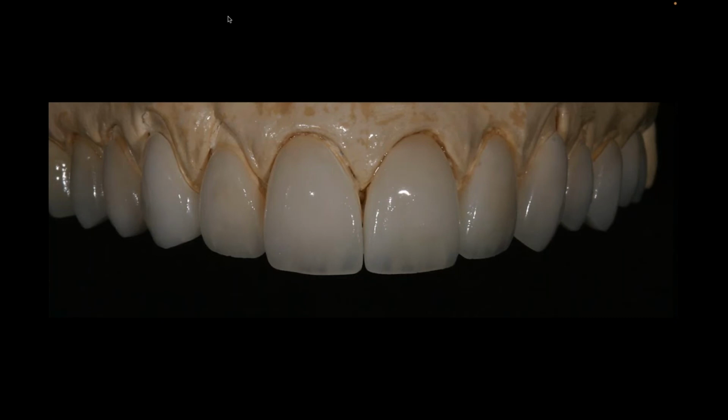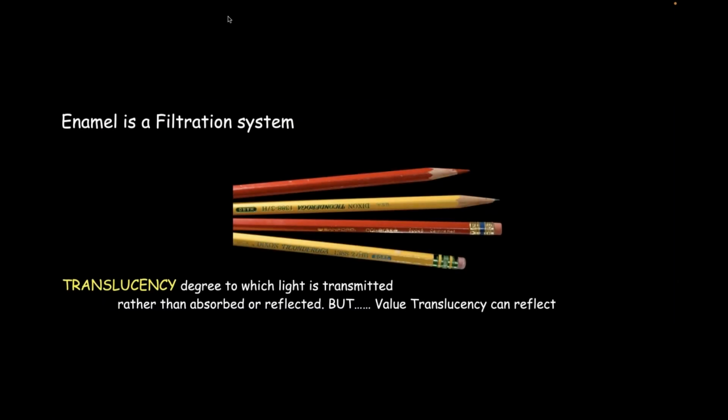And that's why when you pick your value first, you're kind of making a mistake without understanding that translucency that you want. The best example of this was a friend of mine who did this years ago, my friend Adam, and I love using this example. So I want you to look at the colorations you see here on these pencils. And if I really need to use something very translucent, I want you to watch what happens as the translucency gets thicker from 2 tenths to 4 tenths to 6 tenths and so forth.